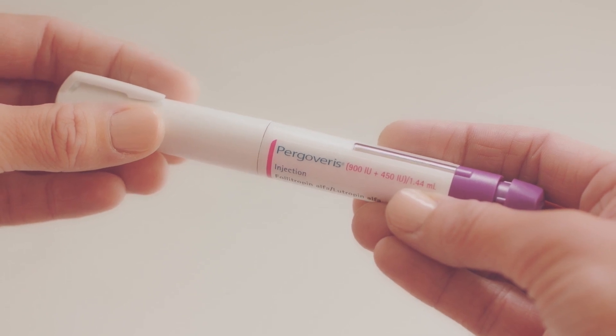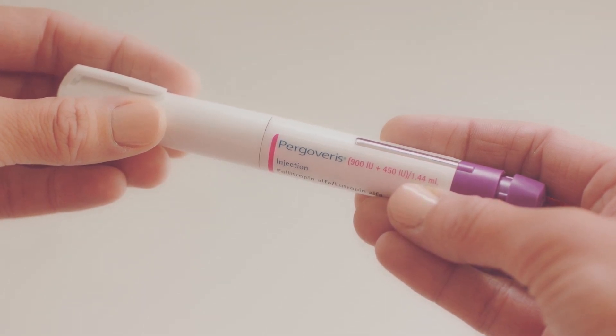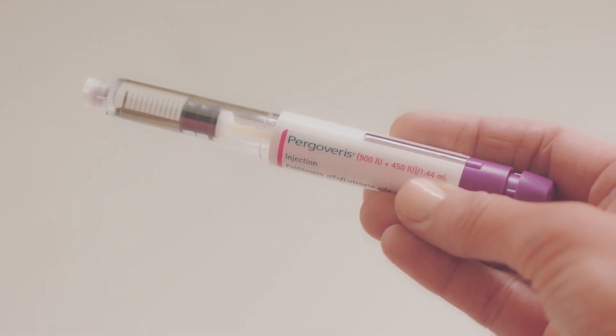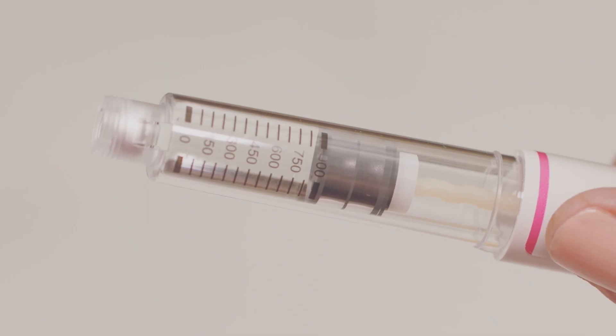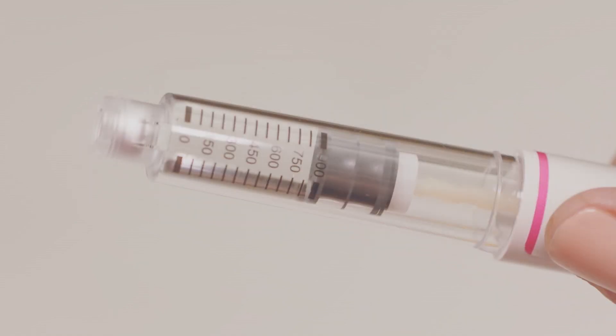If the pen has expired, please do not use it and contact your doctor. Then take the pen cap off so you can take a close look at the solution in the drug reservoir. The solution should be clear with no particles in it. You must only use your pen if the solution is clear and free of particles. If the solution isn't clear and particle-free, speak to your doctor, nurse, or pharmacist to get a new pen. Okay, so mine looks fine.